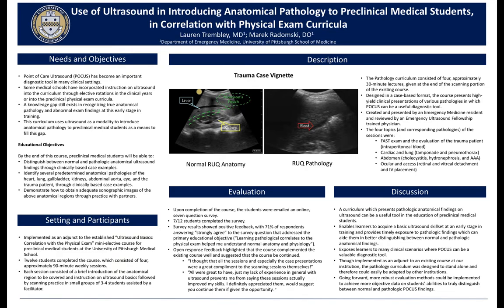The new pathology sessions were implemented after the scanning portions of each weekly session of the original course. So after their scanning practice, they would return to the large group setting and listen to another 20 to 30 minute didactic, this time focusing on the sonographic pathologies corresponding to the regions that they just practiced scanning.